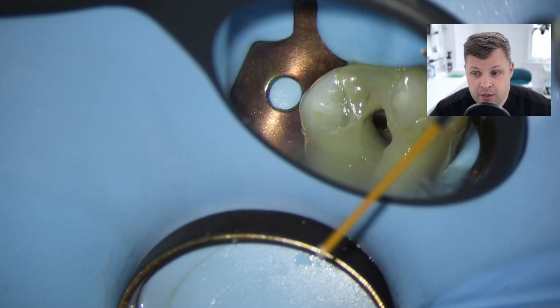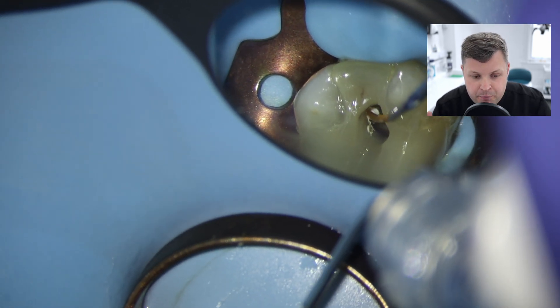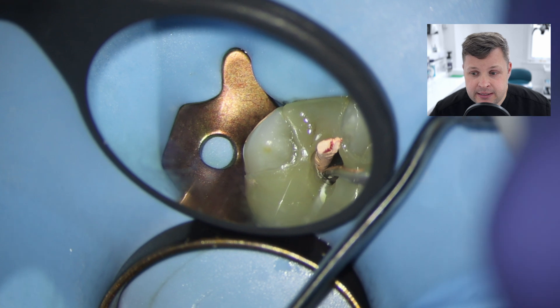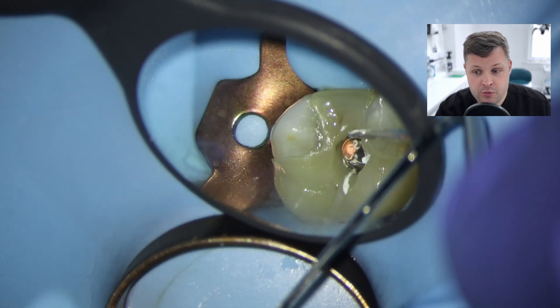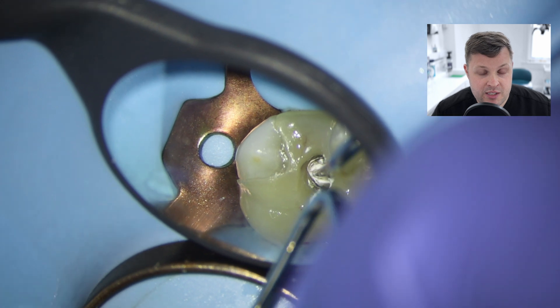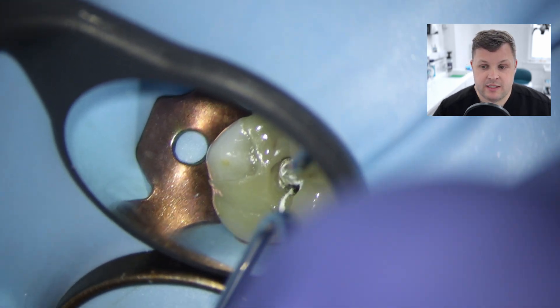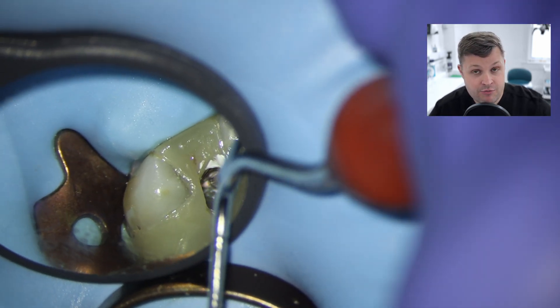We're going to obturate this with one-fill bioceramic sealer using these VSCO tips. The great thing about these VSCO tips is that because of the truss access, they stop us from getting any straight line access issues - these VSCO tips with their sleeves go in nicely. Don't be shy with the bioceramic sealer. Also, cutting off the excess can be difficult, and sometimes if you haven't adjusted the undercut with these very small access cavities, you can get remaining fragments of GP or remaining sealer. It's not the end of the world if you can't get it all out, but it's highly desired that you do, because what you want is the GP at the CEJ and then a monoblock of composite in the access cavity - the most important thing is that you get a good seal, which is really important in root canal.